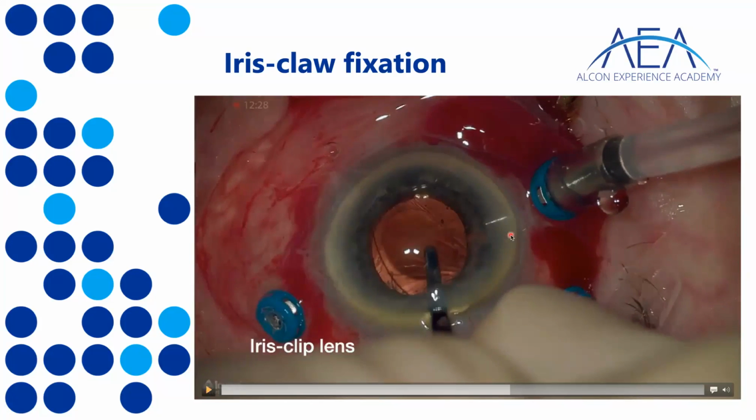So they have to be 180 degrees apart. Why here and here? There is no reason. Could be here and here, could be there and there. It's whatever you are sort of used to, and whatever works best in your hand. In my opinion, to handle the lens as best as I can, it has to be 180 degrees, so let's say east-west. So I insert the lens, of course, north-south like this, and then I rotate it east-west. But the lens can go in whichever position you prefer.